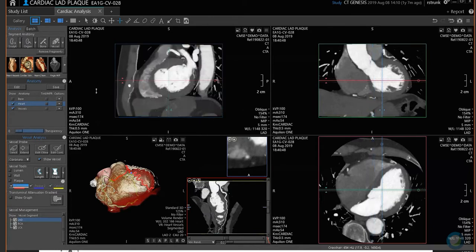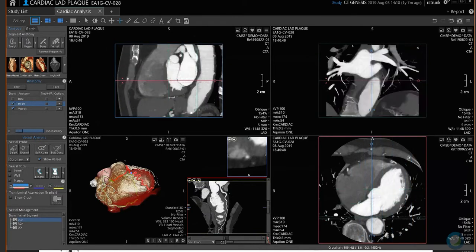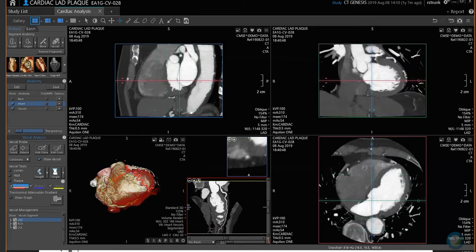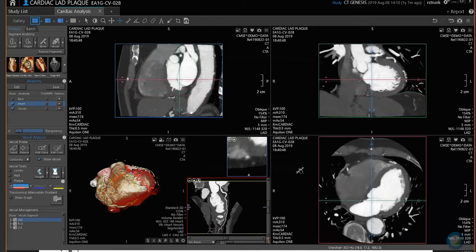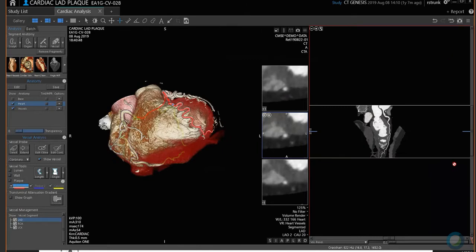Holding your right mouse down is how you scroll through your dataset if you just want to look at a few things. If you would like any of these four viewports one-on-one, you just double-click with your left mouse — click, click — and it hides the other viewports.